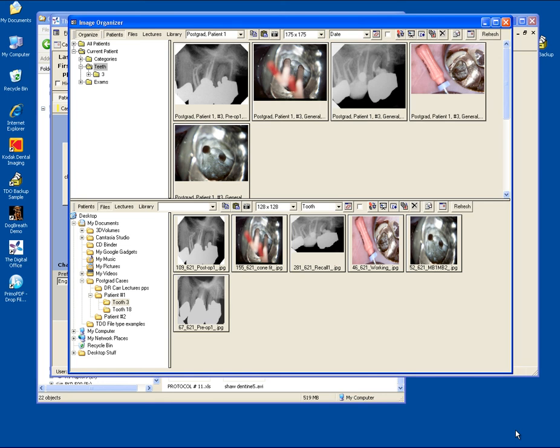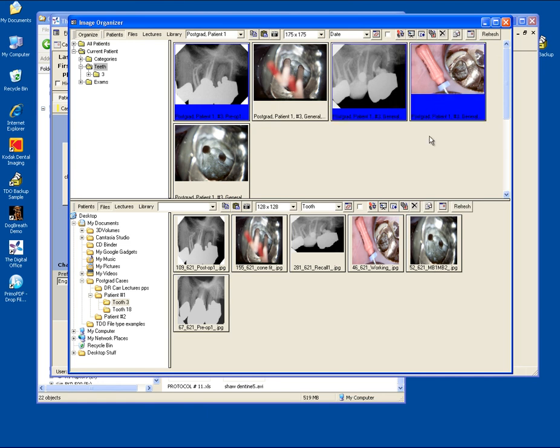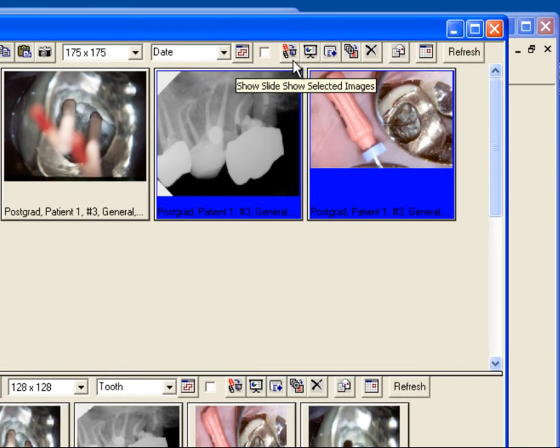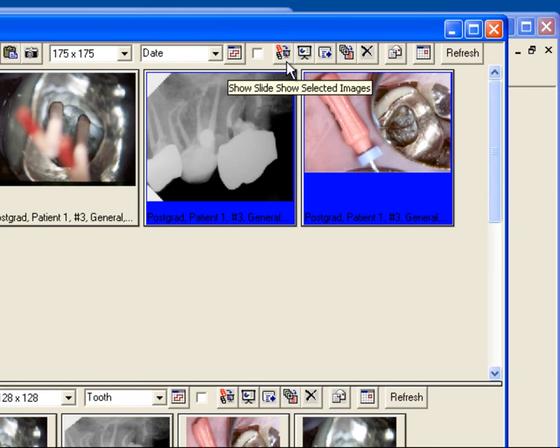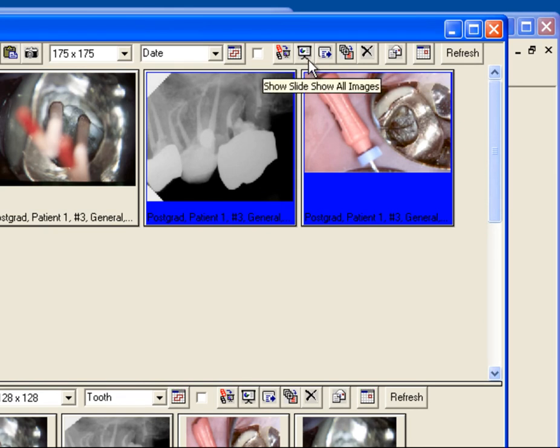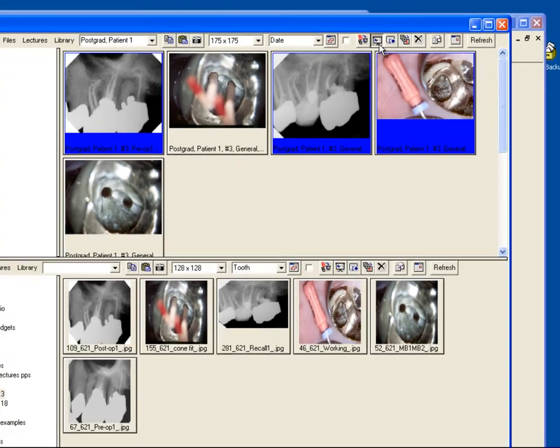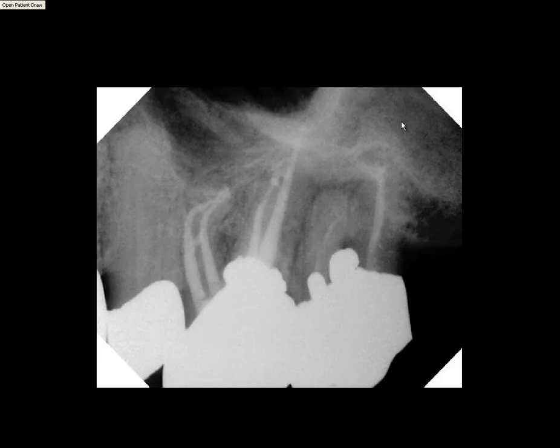Now, to do a presentation, you can select individual images you want to use for your slideshow, and then click the slideshow selected images, or you can automatically do all images in this patient's tooth. When I click the button, it brings up my first image.